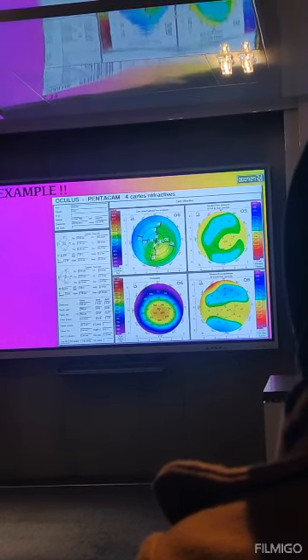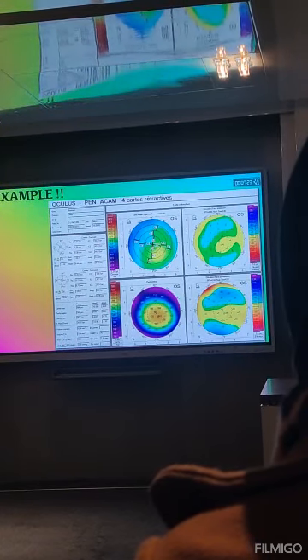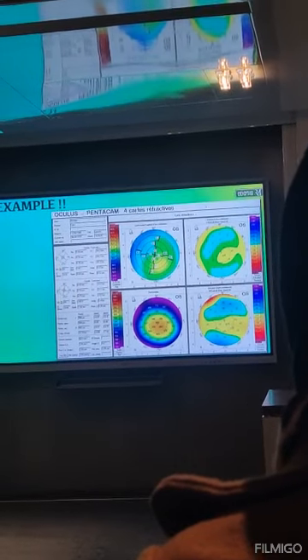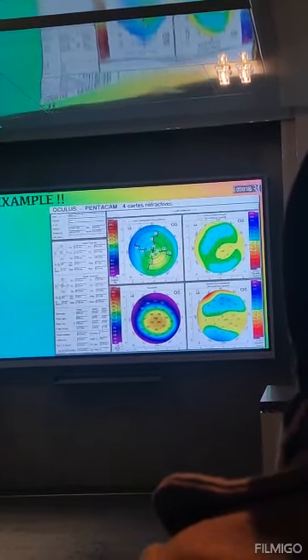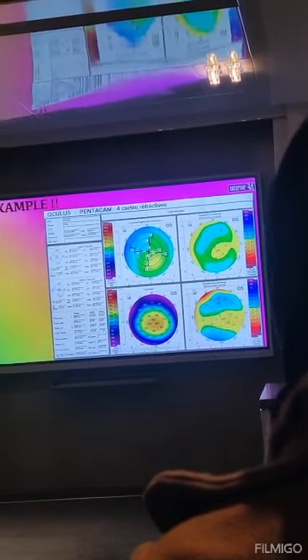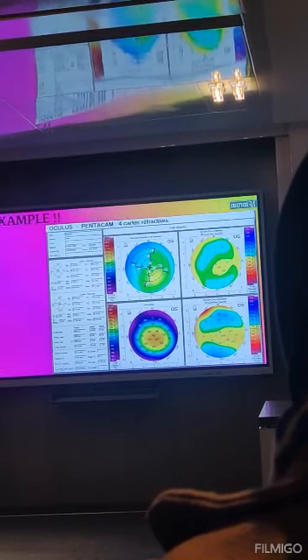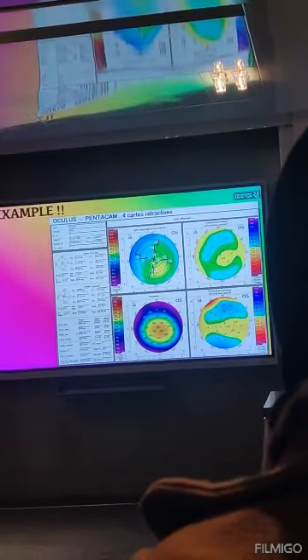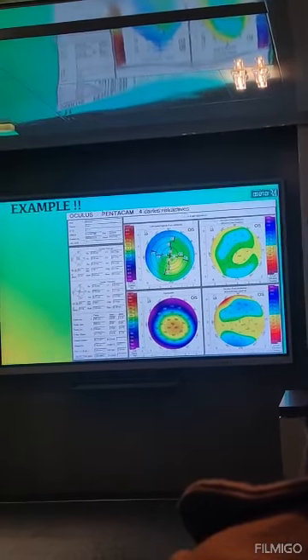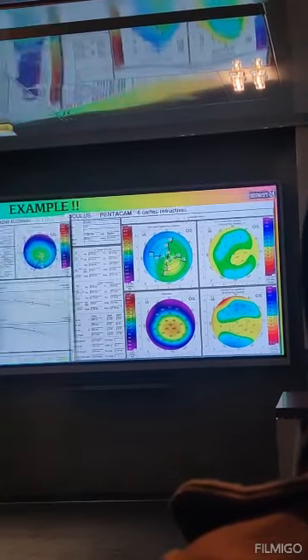Dr. Mazen, please. What about this patient, in your opinion? The asymmetry is about 1.3. Posterior, it's anterior. I used as well the scale of 0.25. That's why it's showing noisy. And the thickness is fine. Yes, everything's fine. Is it keratoconus? No. Is it keratoconus suspect? No, for me, no.